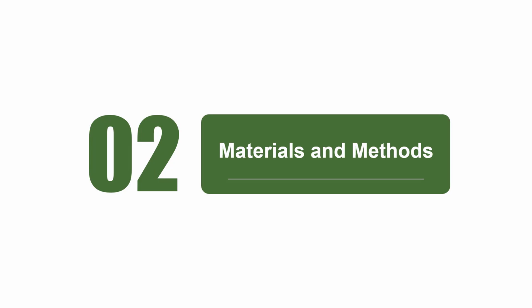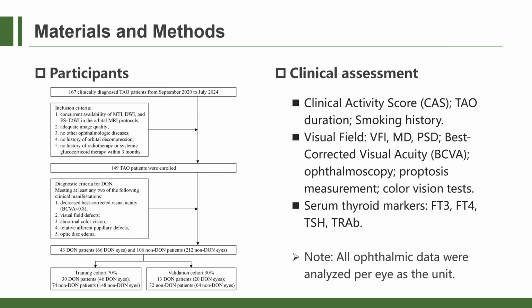Next, the materials and methods part. A total of 149 patients were included in this retrospective study. Patients with and without DON were divided into training and validation cohorts, respectively. For each enrolled patient, a standardized clinical evaluation was conducted. All ophthalmic data were analyzed per eye as the unit.